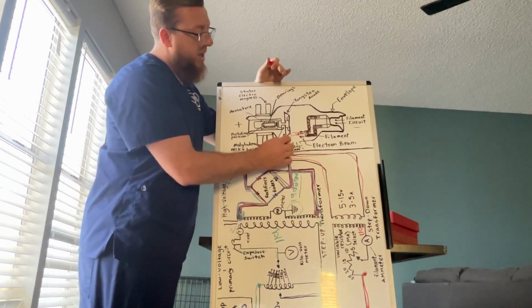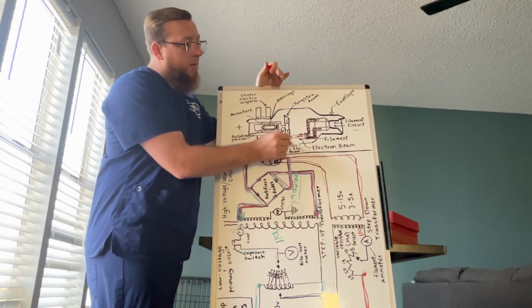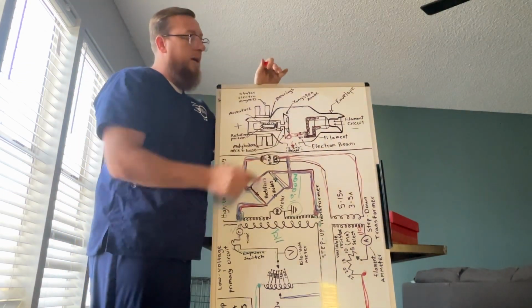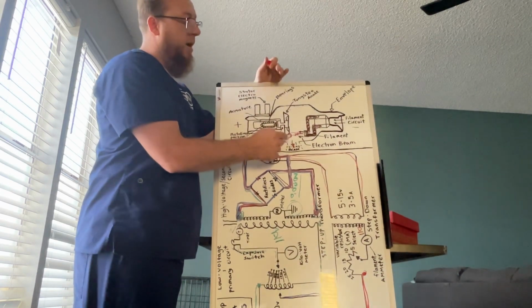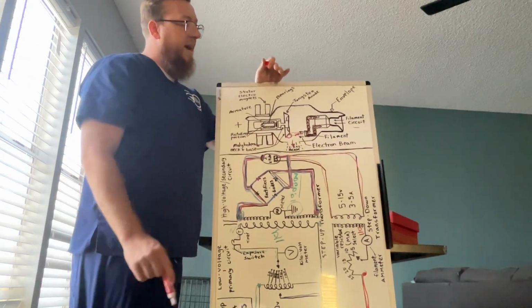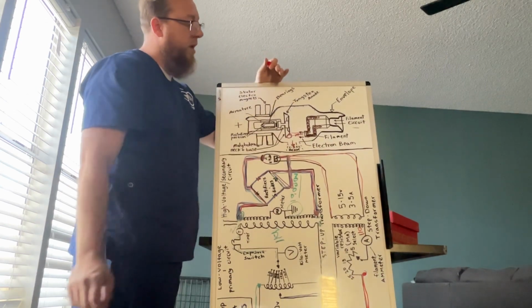Our goal is to hit our 12-degree angle, and they're going to become X-ray photons, and they're going to become our X-ray beam. At this point of contact, that's when our electrons will ionize and change from an electron beam to X-ray photons. Now, not all electrons will be ionized or direct and turn into our X-ray photons.